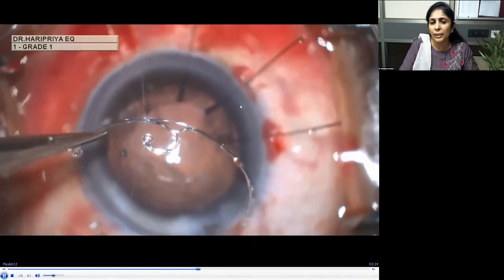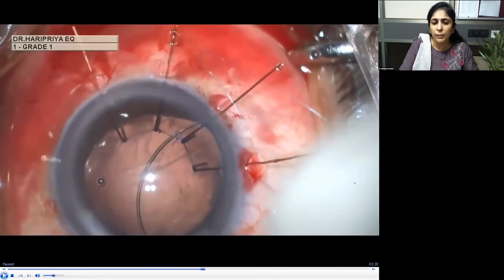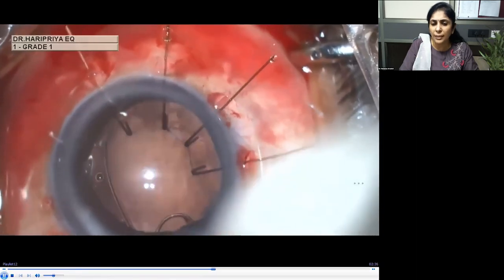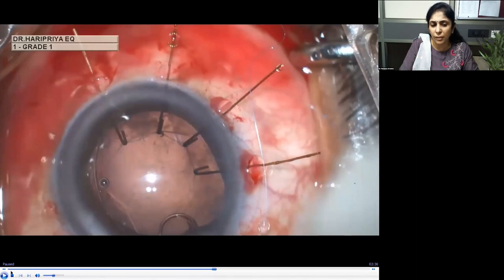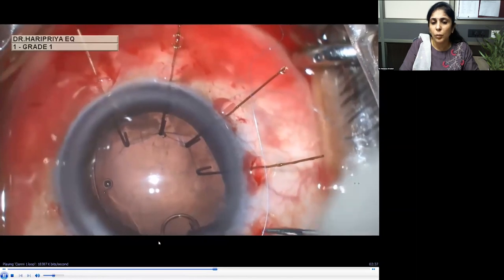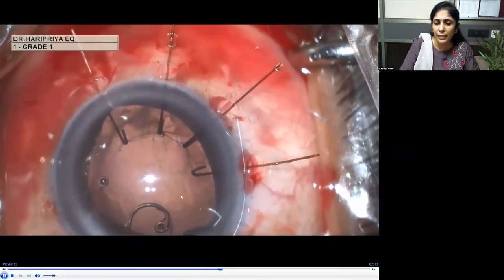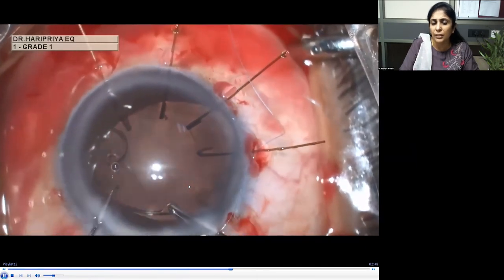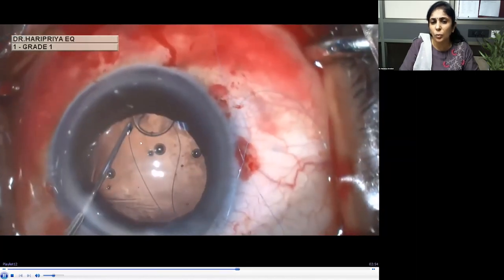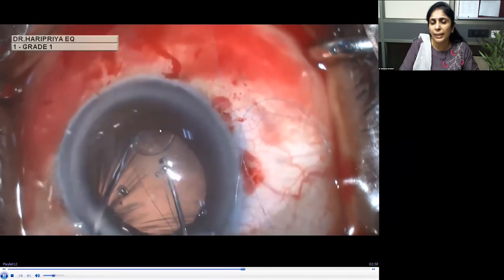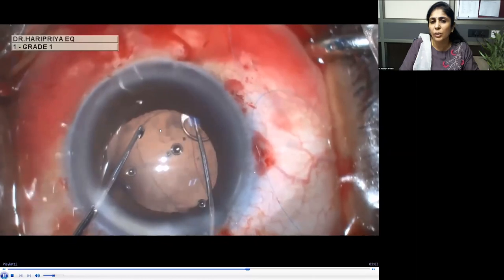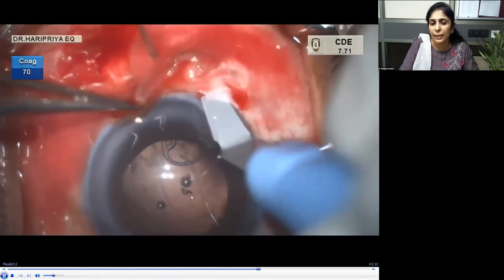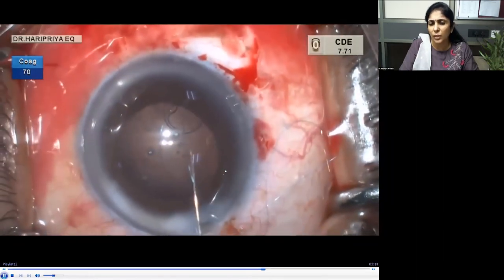After cortex is aspirated, I pre-thread the Cionni ring with a 9-0 prolene suture. I insert it through the main tunnel — not the side port — because of the additional loop. Insert the convex part of the ring first. The trailing eyelet is dialed into the bag. For the Cionni ring, a 2.8 mm incision is needed. Once both eyelets are in the capsular bag and the loop is brought into the sulcus to the site of maximum subluxation, fixation to the sclera is performed using Hoffman's pocket technique.